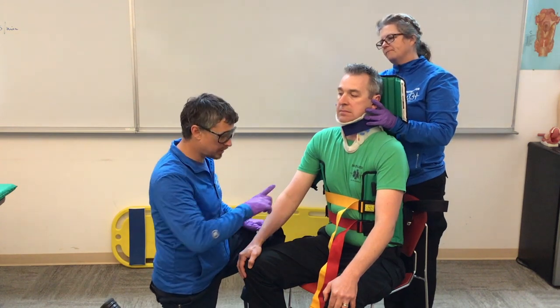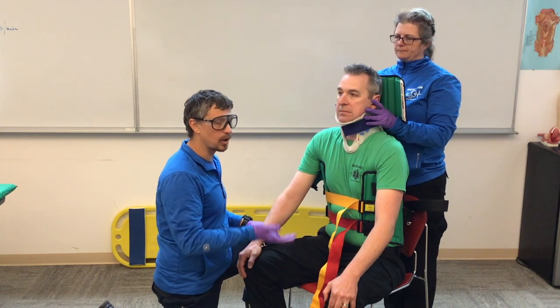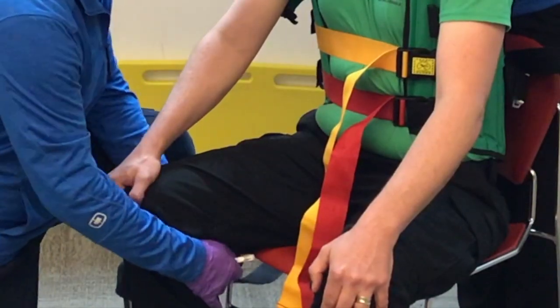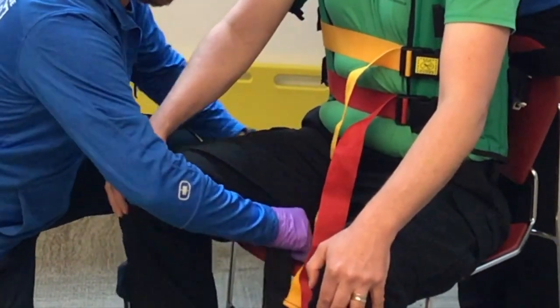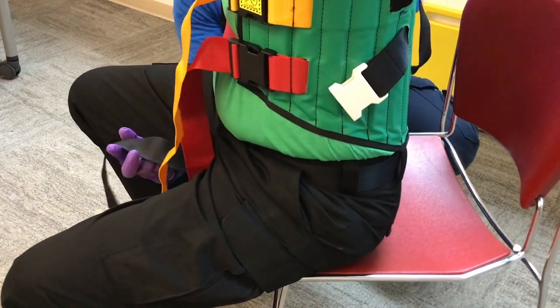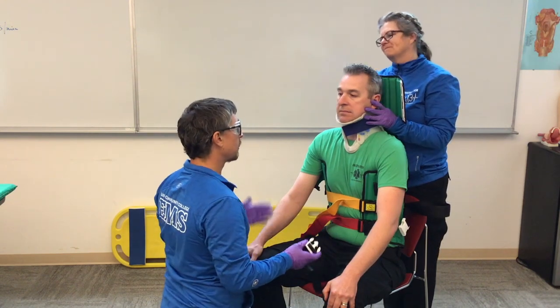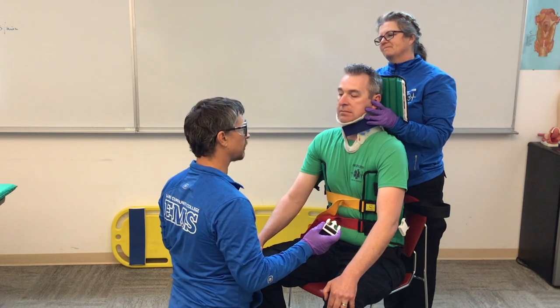With the leg straps there are two options: go under the leg and cross, or — if we have a fractured pelvis — go on the same side. I'll show the crisscross method. I take the patient's right-side strap, slide it underneath the leg, and floss it back and forth so it's in line with the center of his back. I communicate with the patient: this is going to tighten in your groin — if there are any parts you need to move so they don't get pinched, now is the time.